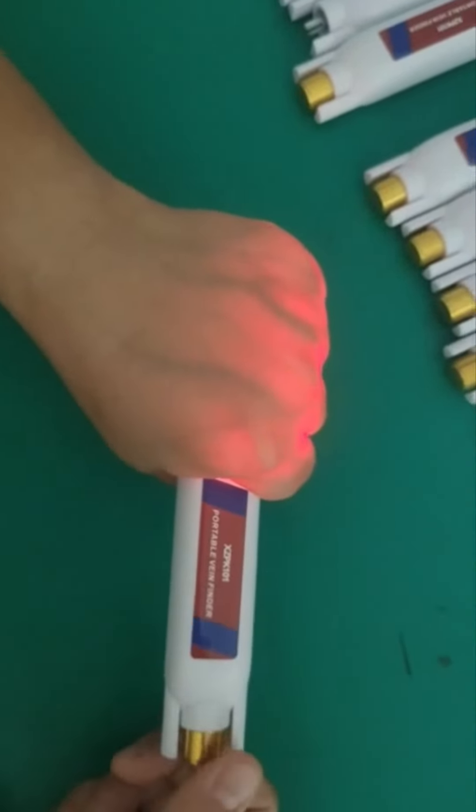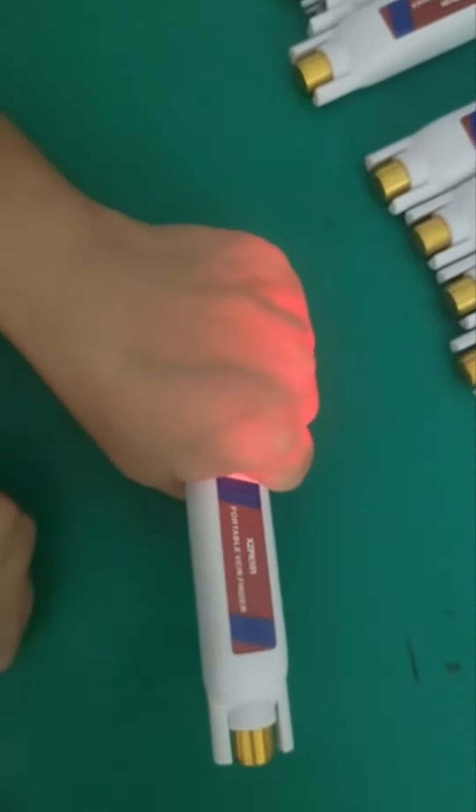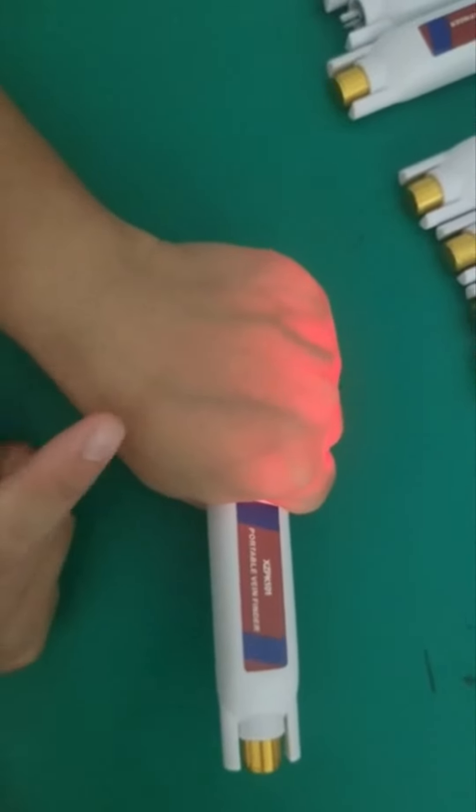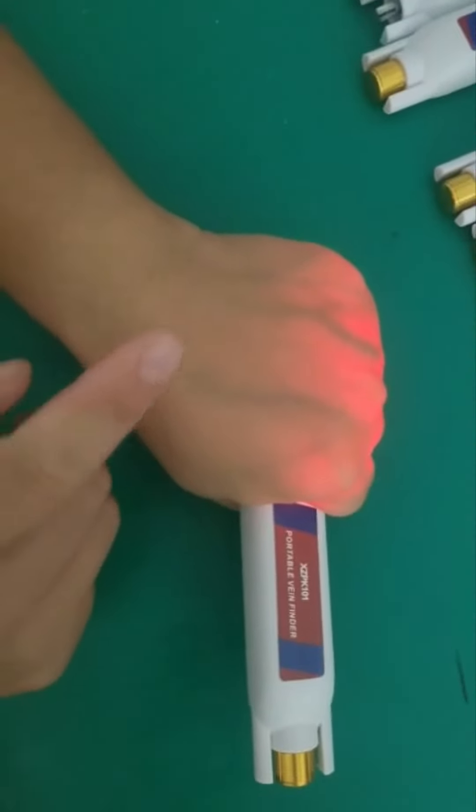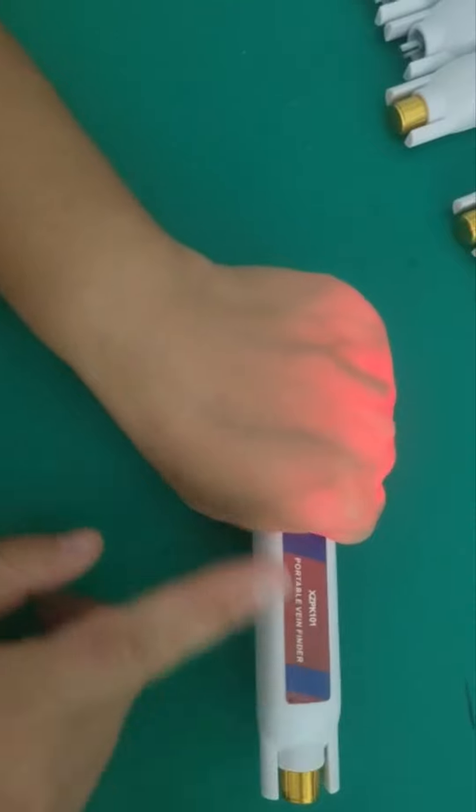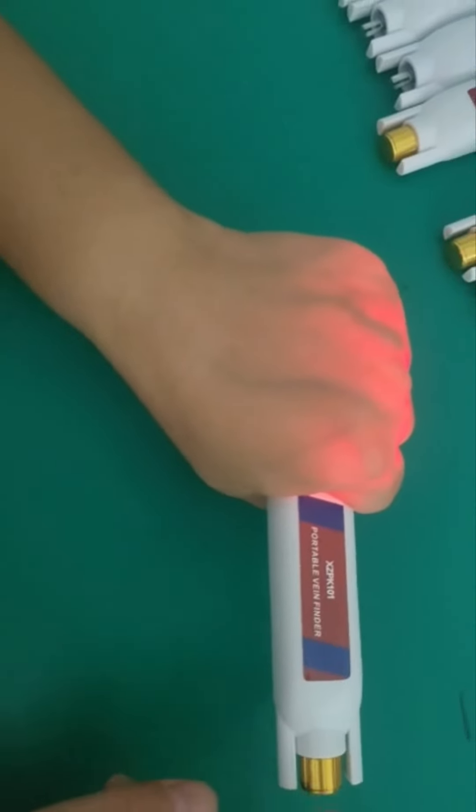If kids use the device, or a single patient uses the device, you can adjust it just a little. Just a little, it's okay.